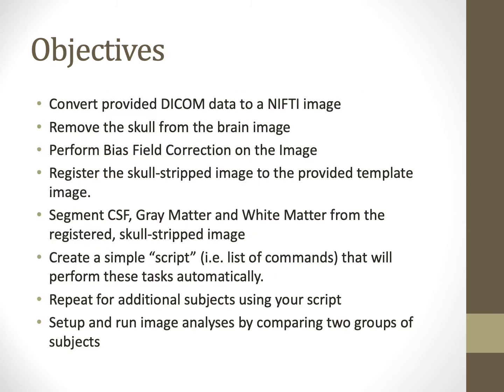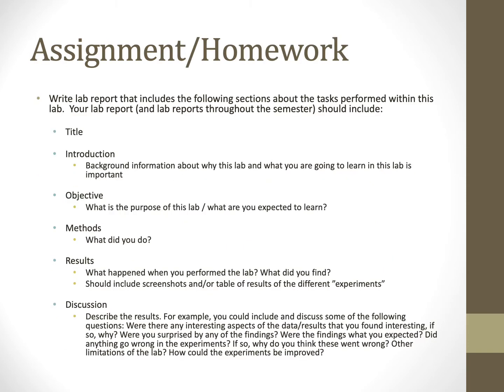From the course Box drive, you will find 5 example datasets labeled test_subject 1 through 5. Each of these subjects contains a T1 weighted image that was acquired from the MRI scanner. The objectives of this lab are to perform each of the following steps for every subject.